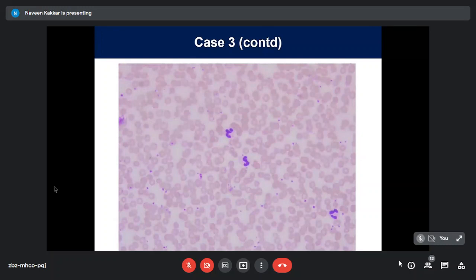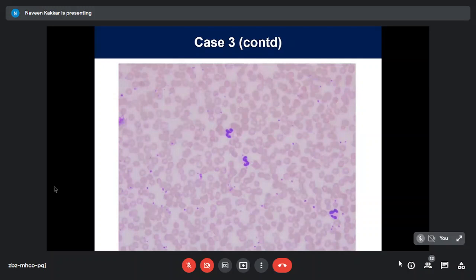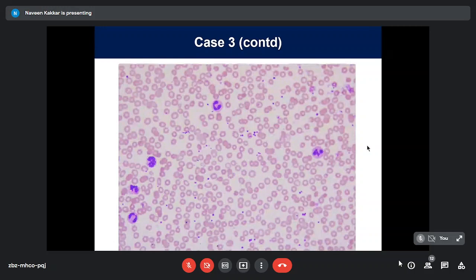How do we differentiate the two? No, there is no need to differentiate. You'll know which smear you're looking at, but if I just enumerate that, the one that is clear is citrate, the one that shows a fuzz is heparin. So heparin stains like this. It gives you a background blue hue, a slight hue to the plasma also. So heparin smears will look like this. That is why they are not used as routine anticoagulants. Citrate is pretty clear, but citrate is liquid, so you have to correct for the dilution factor and give the count.